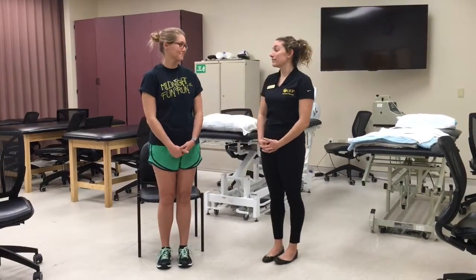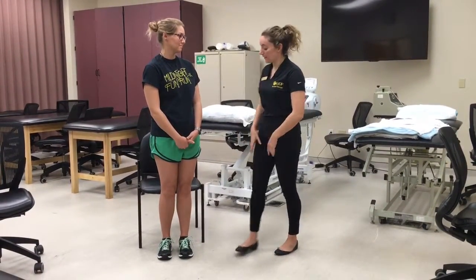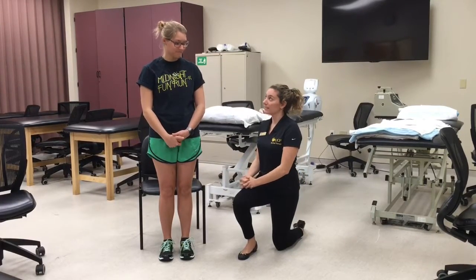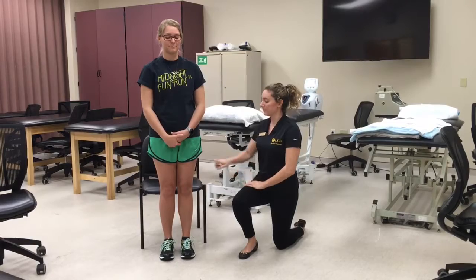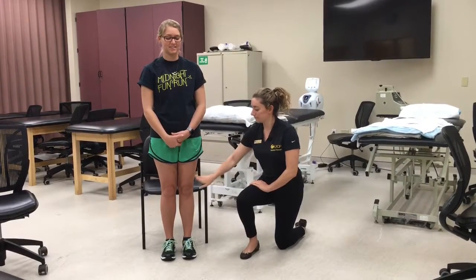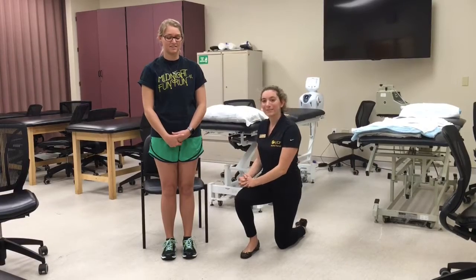Okay, Olivia, I'm going to be doing light touch. The way it's supposed to feel is like this. Can you please close your eyes and let me know when you feel them? Yes, yes, yes, yes. I will then repeat this on the other side.